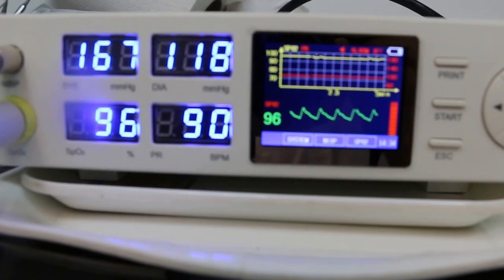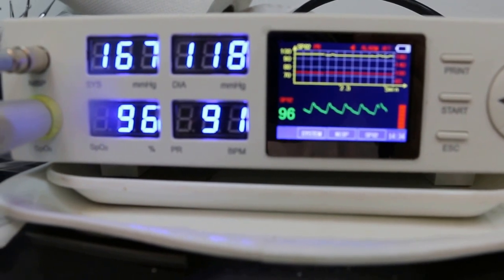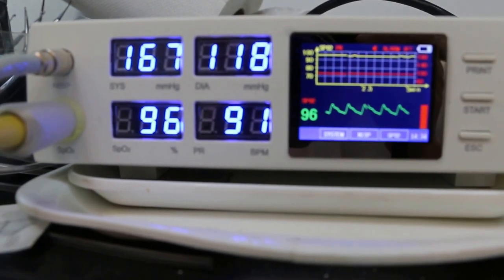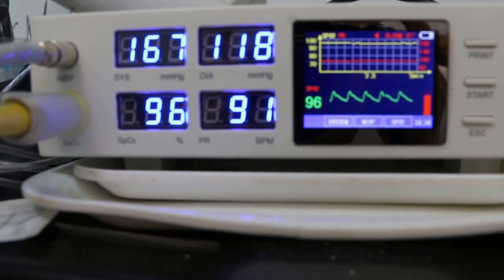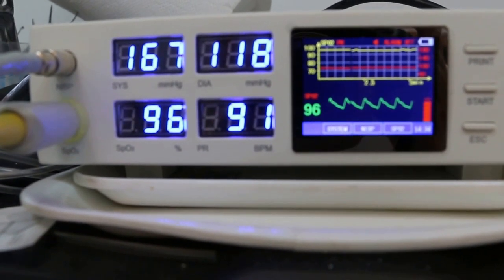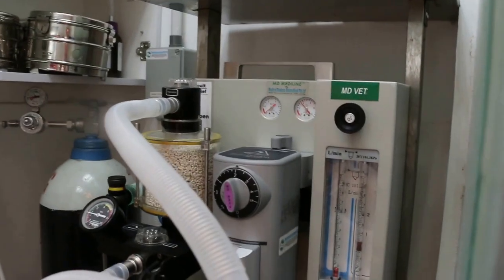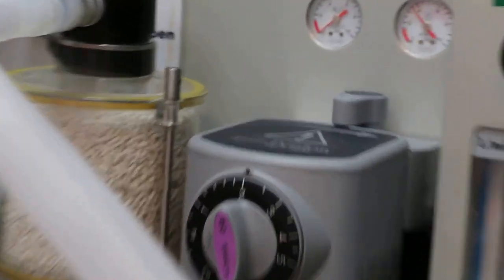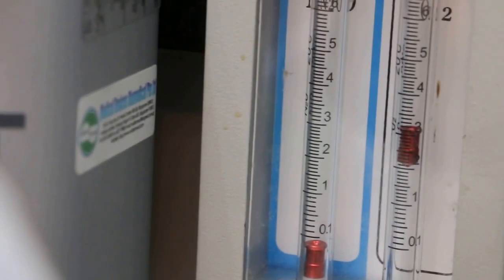May 30th, Geron 5 bladder stone surgery in Ashish Zoo. Monitoring with 2% isoflurane gas and 2 to 3 liters of oxygen.